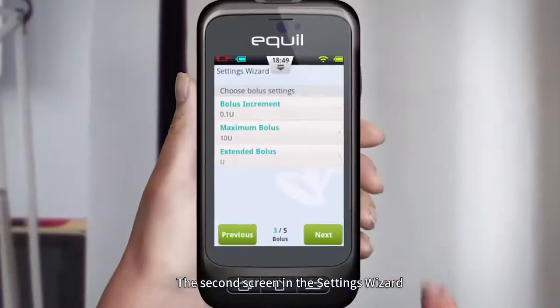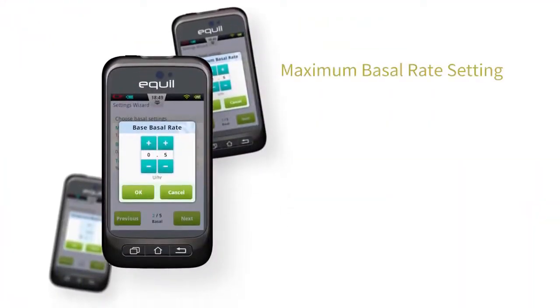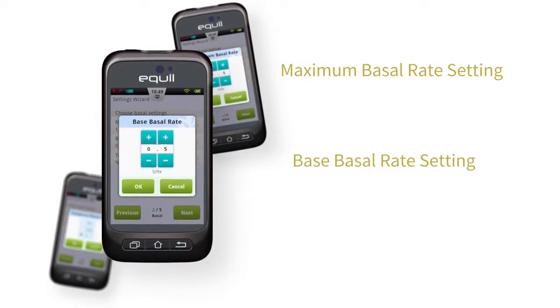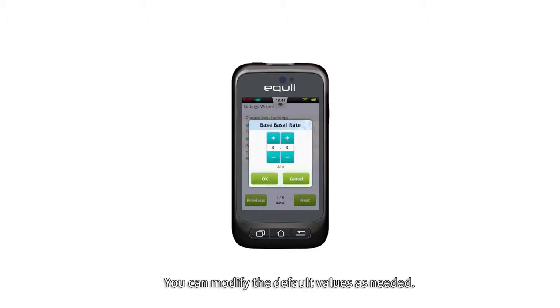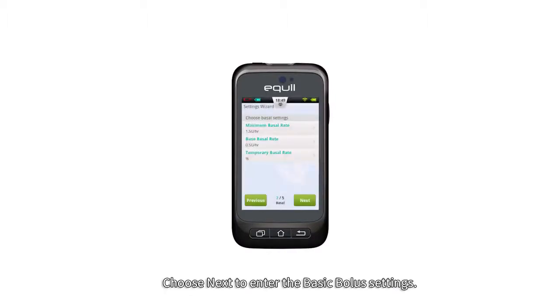The second screen in the Settings Wizard shows the basic basal settings. Include the maximum basal rate setting, base basal rate setting, temporary basal rate setting. You can modify the default values as needed. Choose Next to enter the basic bolus settings.